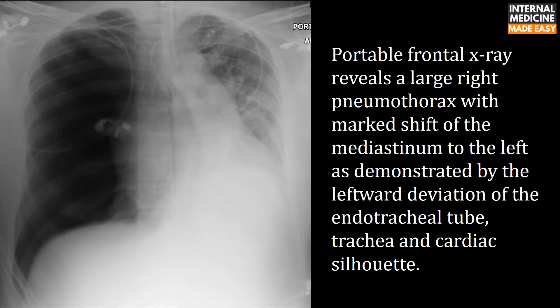This portable frontal X-ray reveals a large right pneumothorax with marked shift of the mediastinum to the left, as demonstrated by leftward deviation of the endotracheal tube, trachea, and cardiac silhouette. The green arrow shows the deviation of the endotracheal tube and trachea; the pink arrow shows the deviation of the cardiac silhouette.